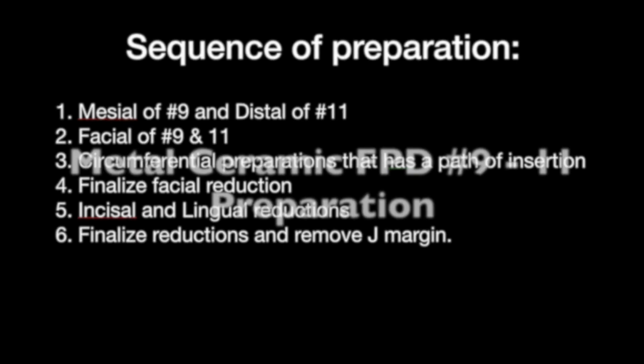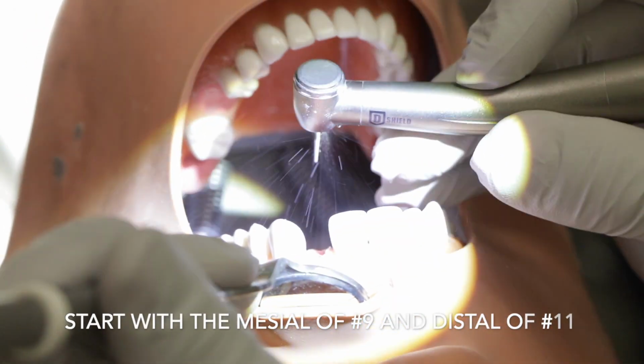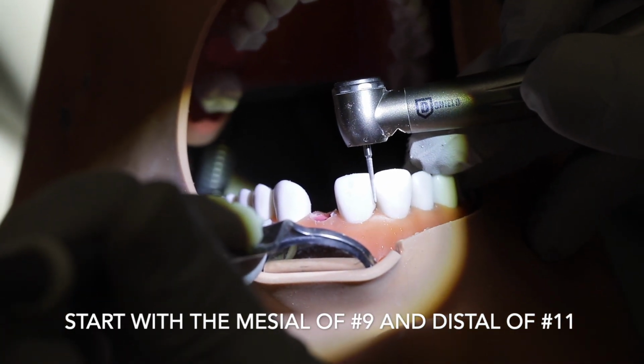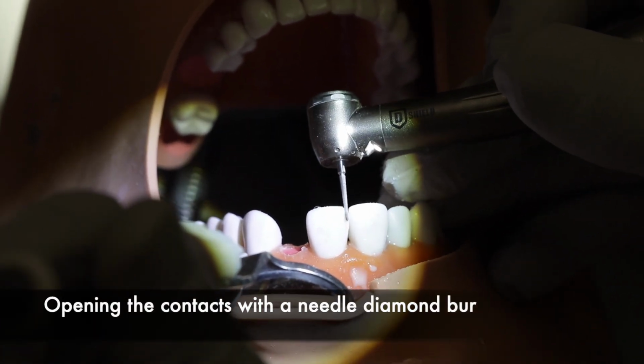This video shows teeth preparation of an FPD from tooth number 9 to tooth number 11 with tooth number 10 missing. I usually like starting with opening the contacts between the abutment teeth and their adjacent teeth.